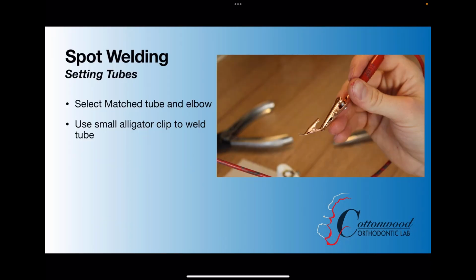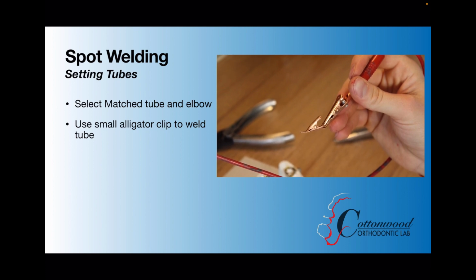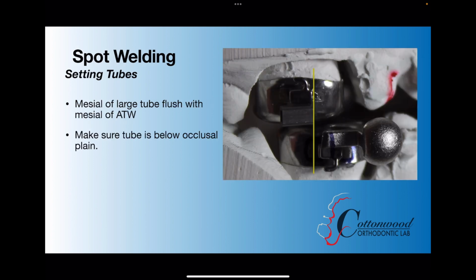We're going to start spot welding the tubes. So with that being said, we've got this little alligator clip we like to put on the other alligator clip, and then you should grab a selected matched tube and elbow. It is super important to have an elbow that's matched with the tube. If you have too much play in your elbow and tube relationship, you can jump your cams because they can just have too much play in that appliance and it rocks back and forth.